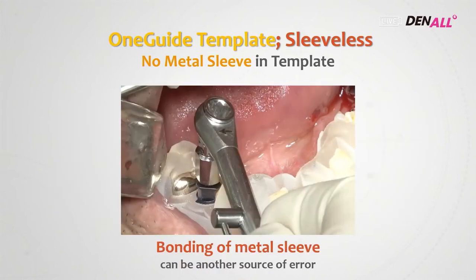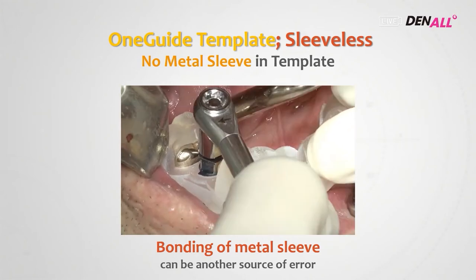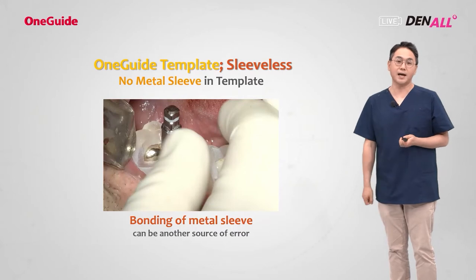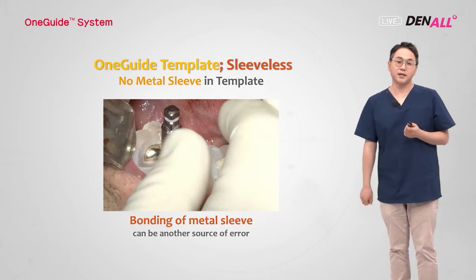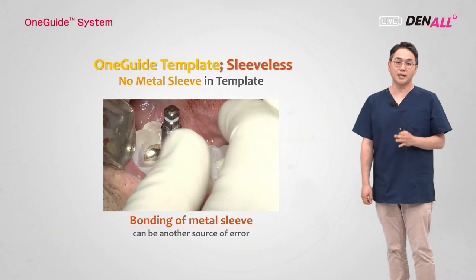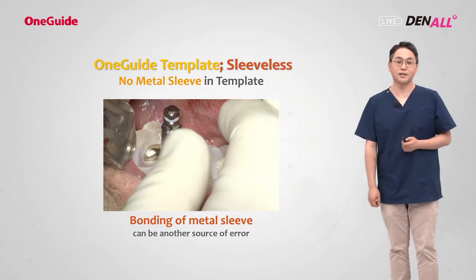The second reason: if you look at this video, many doctors say the metal sleeve itself increases the accuracy of implant placement. That is not the case. The metal sleeve is a stock product, but the surgical template is printed by a 3D printer. After that, a dentist, lab technician, or digital center does the positioning of the metal sleeve. In positioning it, if the metal sleeve doesn't go in properly and there's an angulation error, the drilling would have errors and the placed implant would have errors. Bonding of the metal sleeve may have positioning errors that can lead to drilling and implant placement errors, so I don't trust it that much.